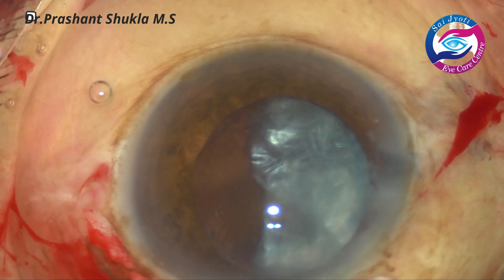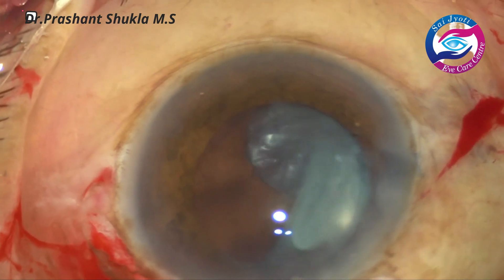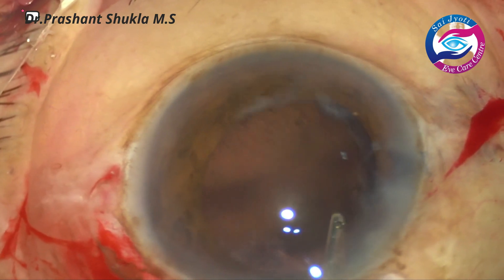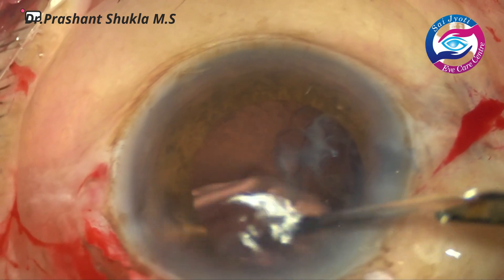A thick sheet of epinucleus and cortex is left. Using the same Simcoe cannula through the main port, the fluid jet is directed below the cortex, and when the fluid jet is directed below the cortex the cortex comes out without any need for aspiration.